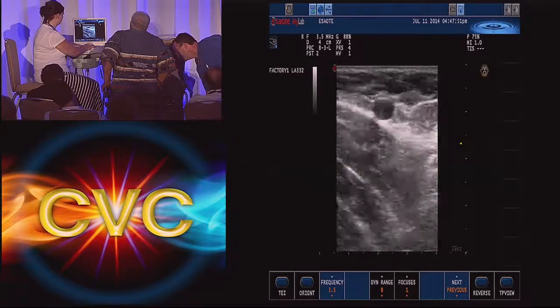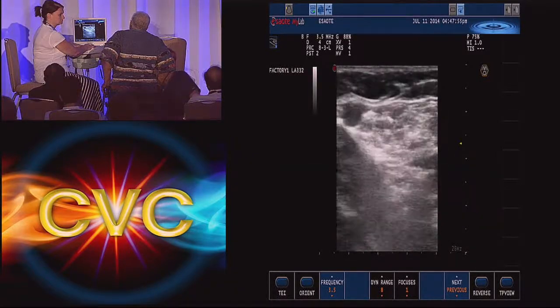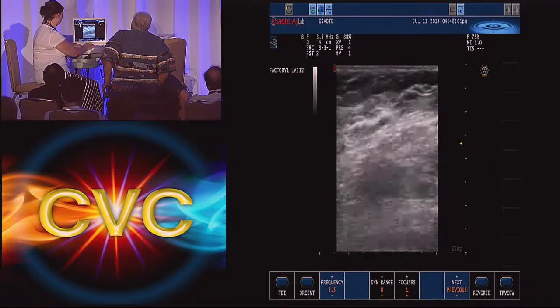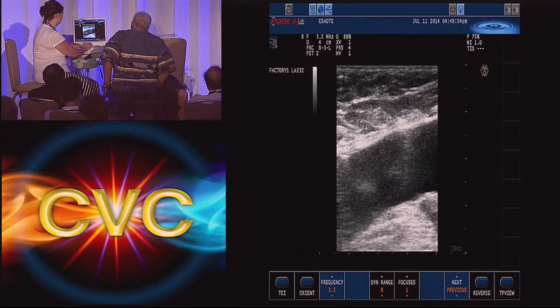Do you see the patient first before you do the ultrasound? I always see the patient first. And then you tell the tech what to do. Yeah, so first thing in your mind is the deep must be open. So I make sure the deep ultrasound is normal. No evidence.